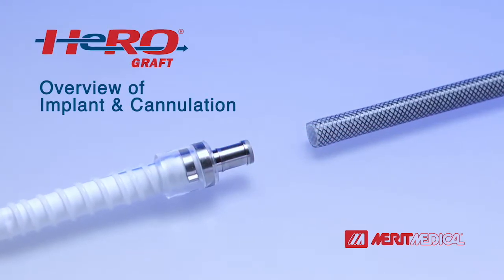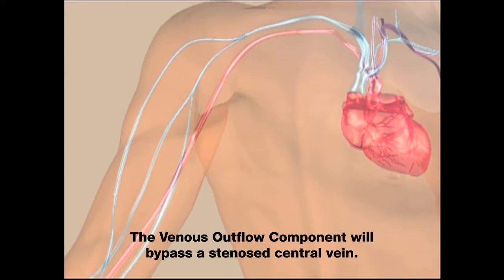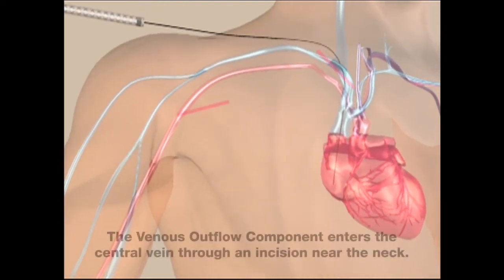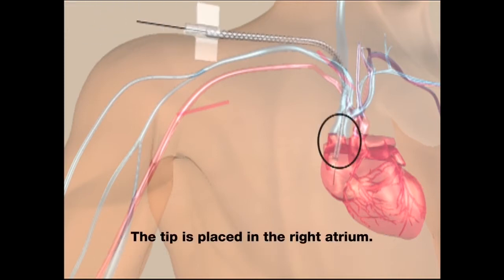Overview of implant and cannulation. HeroGraft is surgically implanted under the skin. The venous outflow component will bypass a stenosed central vein. It enters the central vein through an incision near the neck, and the tip is placed in the right atrium.